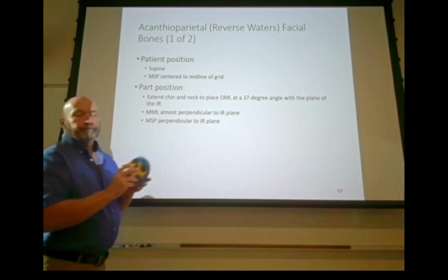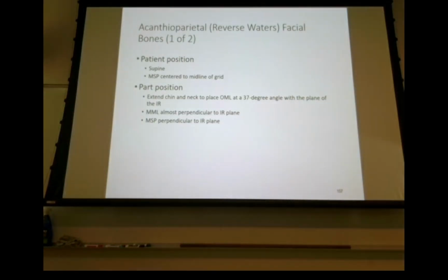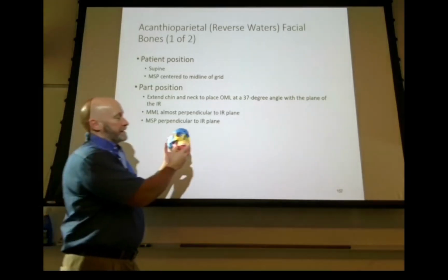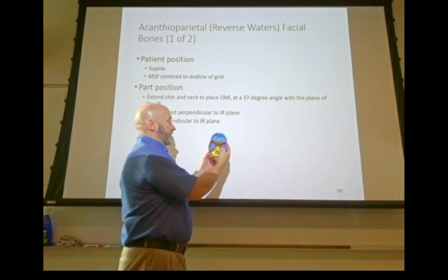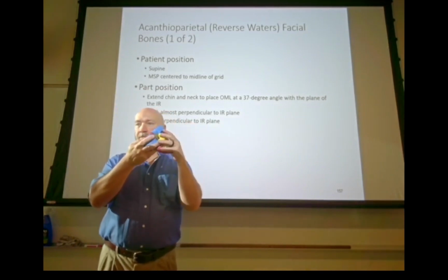Okay? Modified Waters is going to be positioned with the acanthomeatal line perpendicular. Okay? So instead of having just the chin on the image receptor, what you're going to have is the chin and nose on the image receptor.